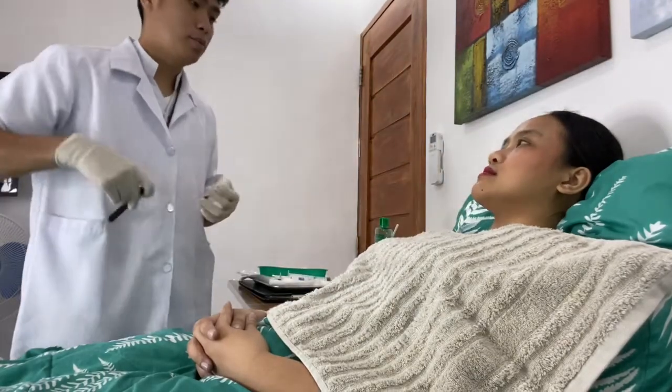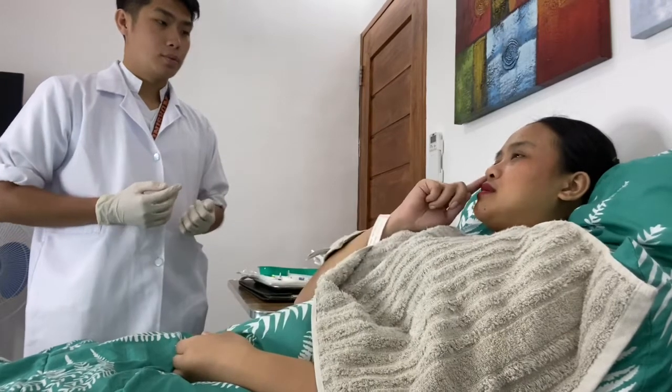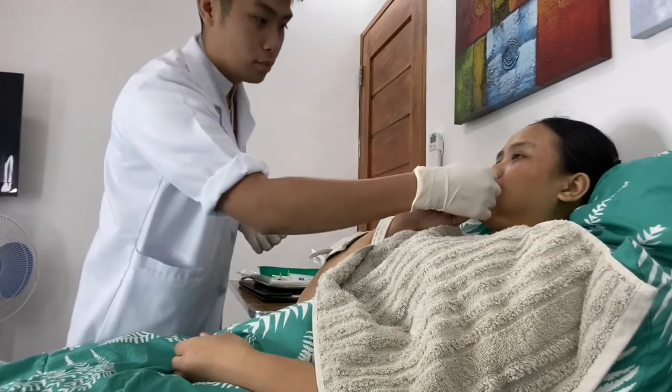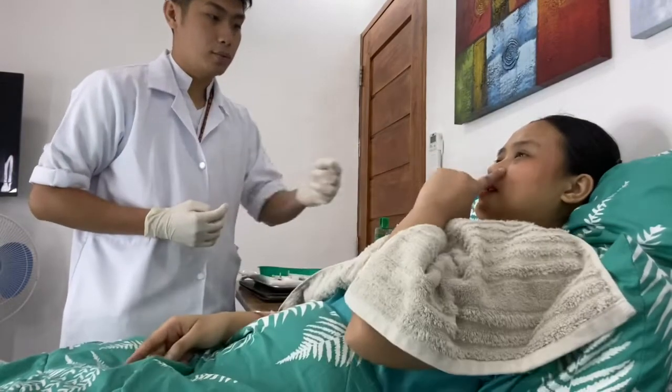Okay, ma'am. Assess for the patency of the nose before you begin. There might be a problem with the continuous passage of the airway of the patient. Ma'am, can you put your finger on one of your nostrils and then blow? Okay. Ma'am, can you do it on the other side? Okay.